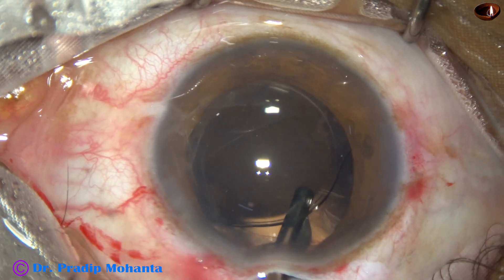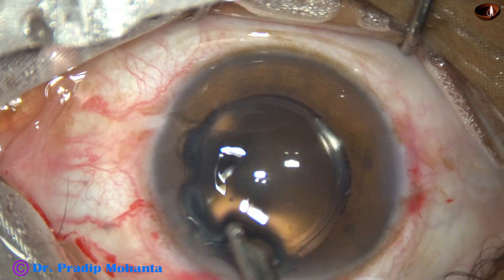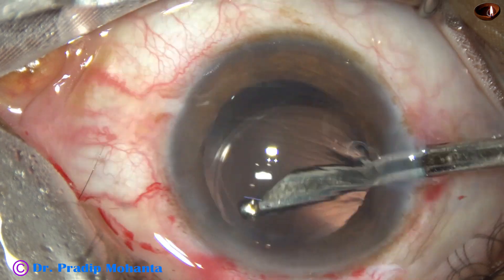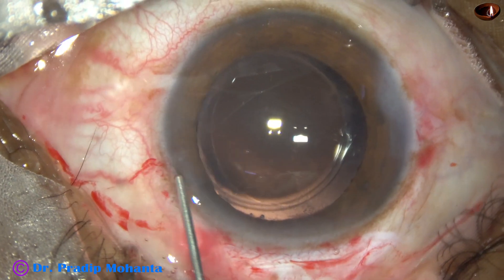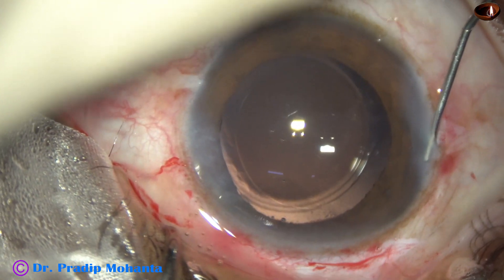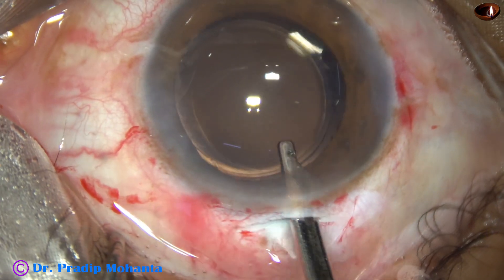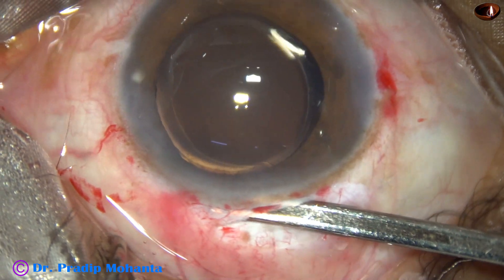Now I am irrigating the capsular bag as well as the anterior chamber to remove the visco. There was a bit of cortex at 11 o'clock, which has been removed. I go through the side port again and remove some more visco. My plan is not to use any automated machine like a phaco machine for this surgery. The side ports are closed by hydrating the corneal stroma. The sclerocorneal tunnel has been constructed in such a way that it is self-sealing.